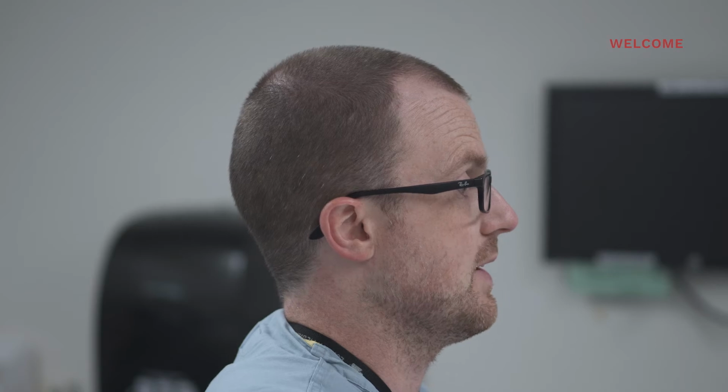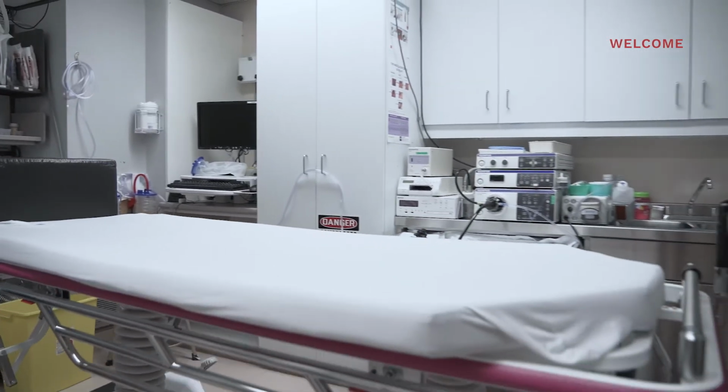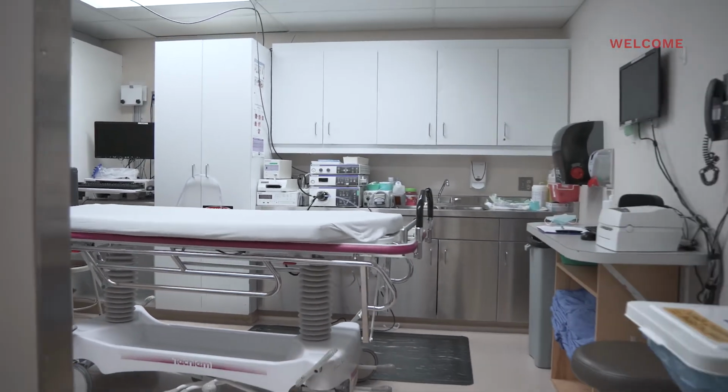Envision laparoscopy done with long floppy instruments and a long floppy camera operating on a long floppy organ. Yet ever advancing techniques, increasing indications, and an aging population all demand an ever improving skill set. The purpose of this training video is to provide insight into the technique of colonoscopy and to teach you how to become a skilled, efficient, and safe endoscopist.